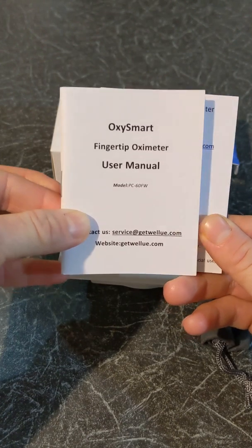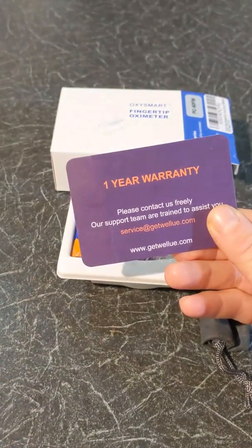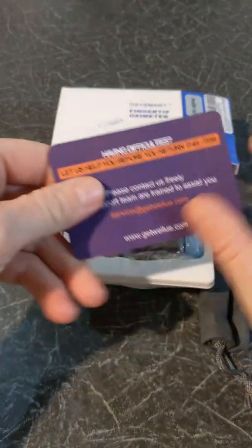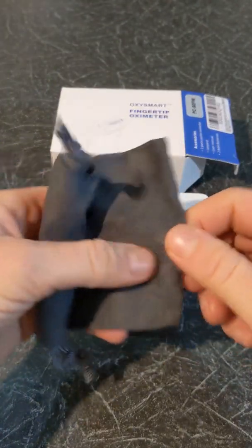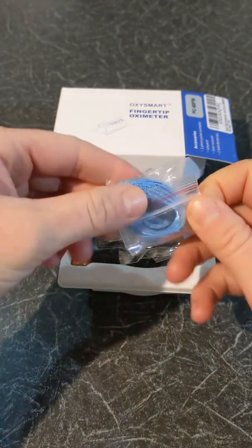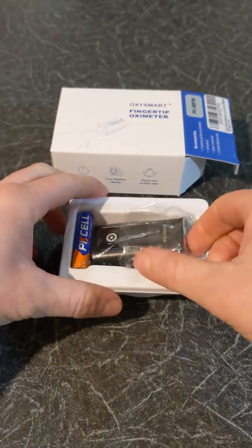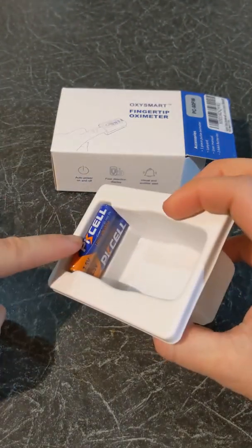Inside the box there is the user manual, a quick guide, a warranty card with the support contact details, a small bag for your oximeter, a strap, the oximeter, and two batteries.